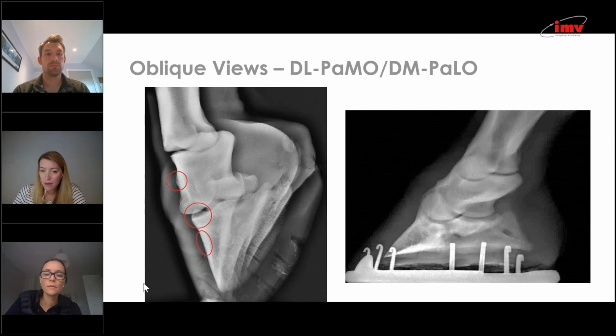So again, I think it's important to look in that region, but also, as demonstrated by previous studies, the palmar process is really important, the base of any ossification of the ungular cartilages. And it's also quite nice, it skylines the medial and lateral proximal aspects of the navicular bone. With foot radiographs, we usually get the distal half or possibly two thirds of the proximal phalanx. And again, the palmar medial and lateral aspects are where the oblique sesamoidean ligaments attach, and it's possible to see modelling in that region, which you otherwise wouldn't pick up.